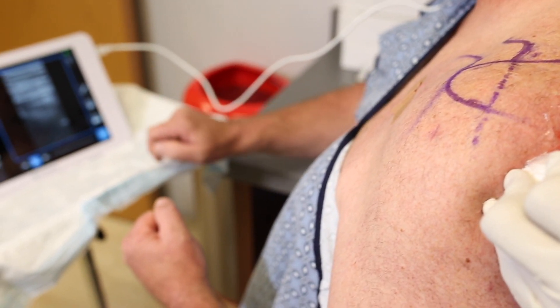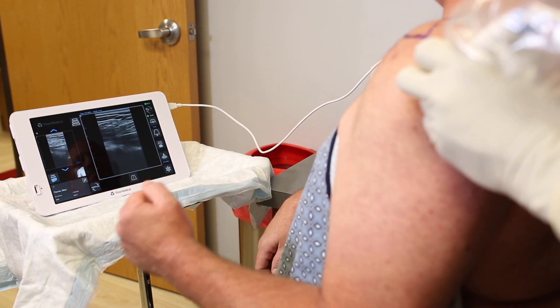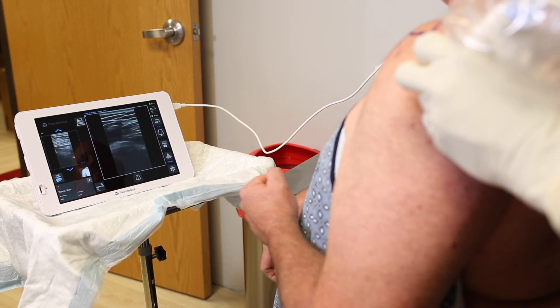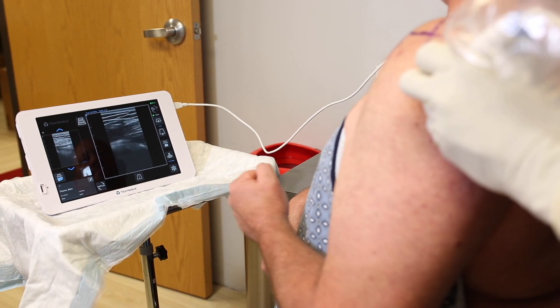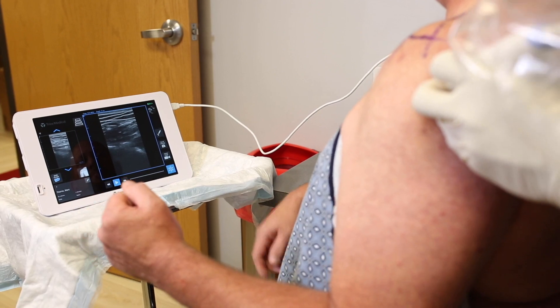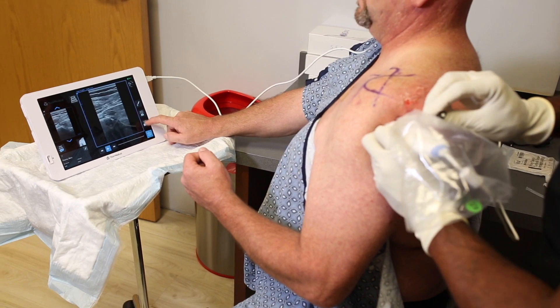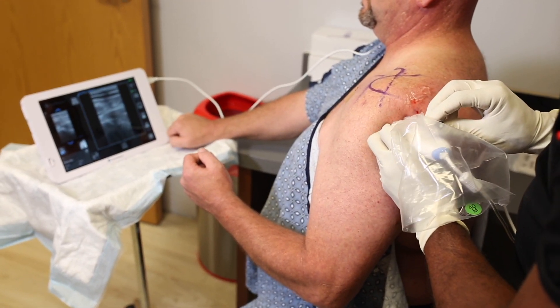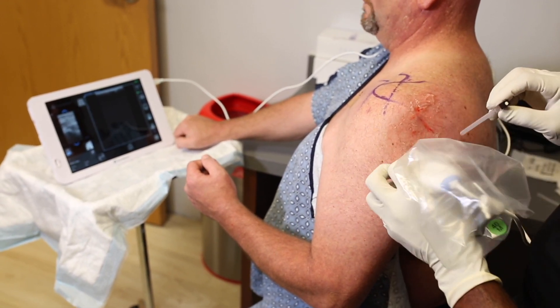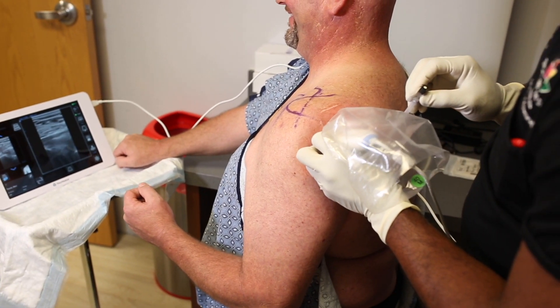Here we can see the bony anatomy on the superior shoulder. We're about to take a 22-gauge spinal needle and use it to directly enter the joint in an off-axis injection under ultrasound guidance. The 22-gauge spinal needle is just superior to the transducer, traveling parallel to the transducer right down the middle, into the glenohumeral joint. We can watch that dynamically on the ultrasound monitor.